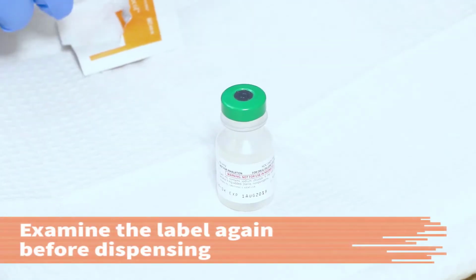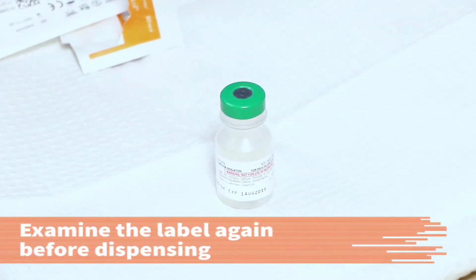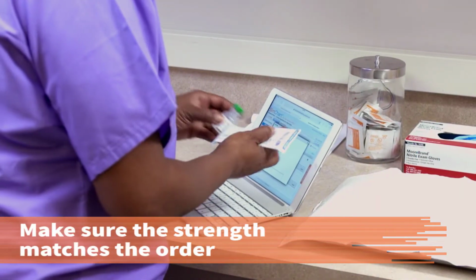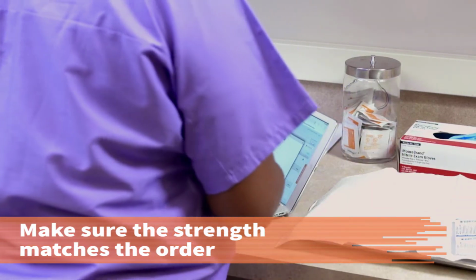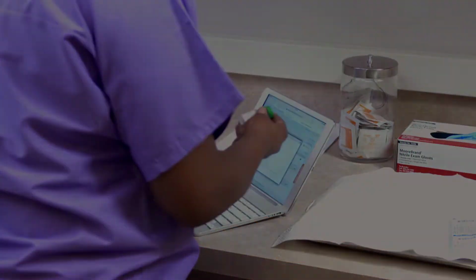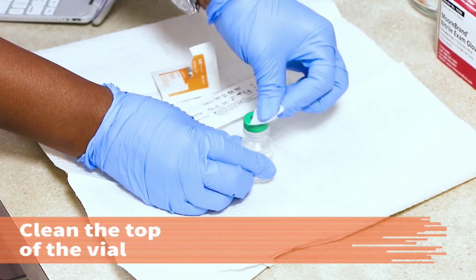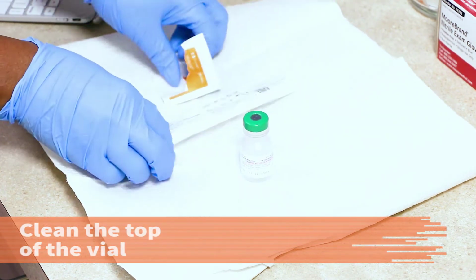Examine the label on the vial of medicine again just before dispensing the ordered dose. Make sure the strength on the label matches the order, or that you dispense the correctly calculated dose. Clean the top of the vial with the alcohol wipe using a circular motion. Place the vial on a flat surface.